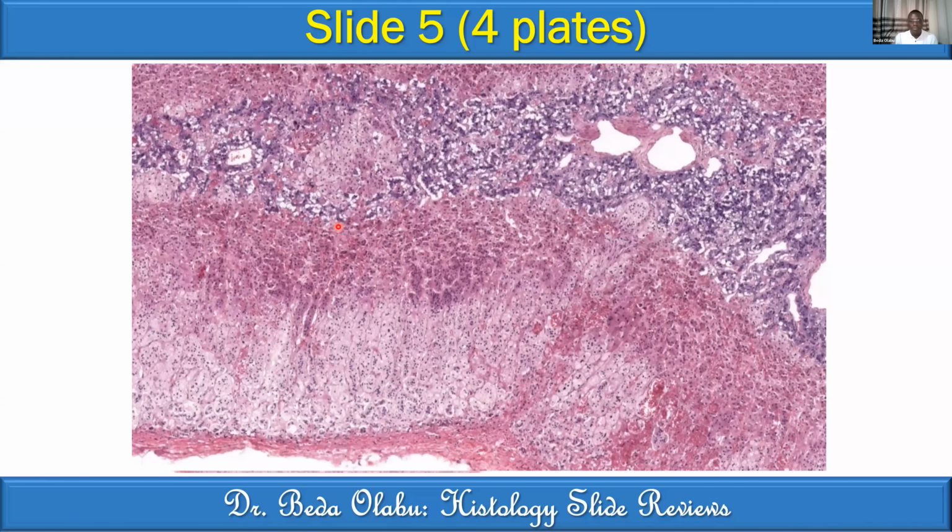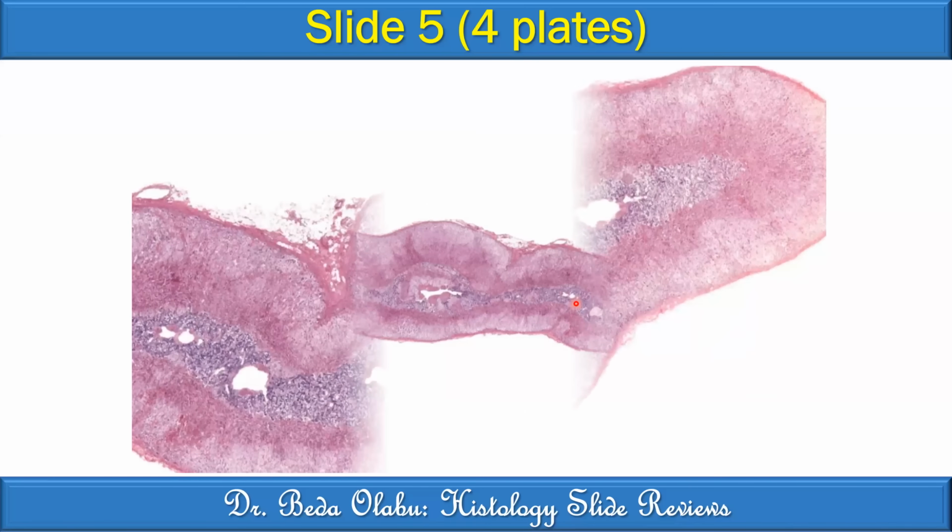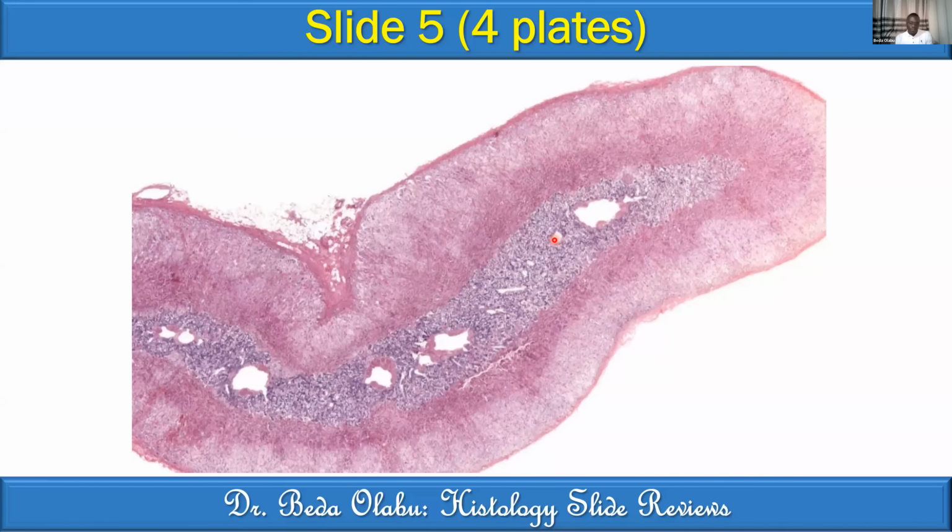So I'll take it back to the lowest magnification. What can you capture? From the first magnification, I can see that there's a capsule around the gland. Then it seems like the gland has 2 layers of cells. The outer cells are closely packed. Then there are inner cells that are deeply staining and have some large spaces in between. Okay, good. And blood vessels are there in the inner layer where the cells are deeply staining.